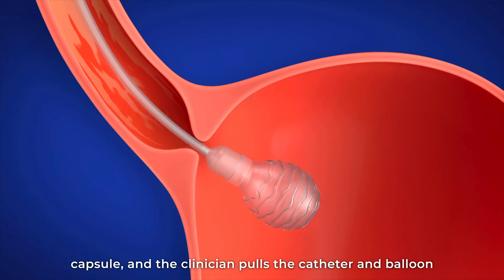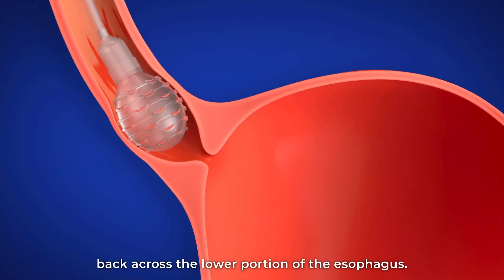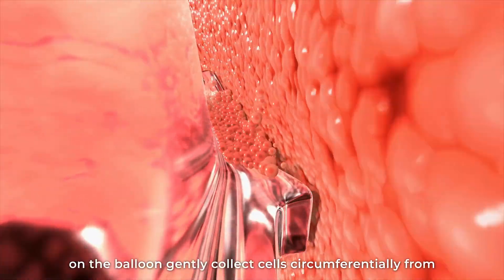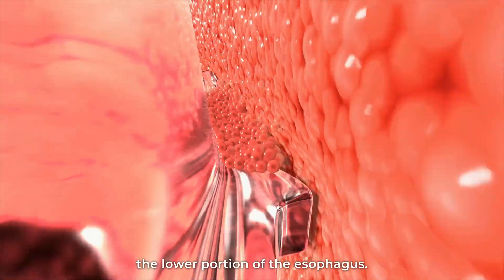Once in position, air inflates the balloon within the capsule, and the clinician pulls the catheter and balloon back across the lower portion of the esophagus. As the ESOCHEC is pulled, proprietary textured ridges on the balloon gently collect cells circumferentially from the lower portion of the esophagus.